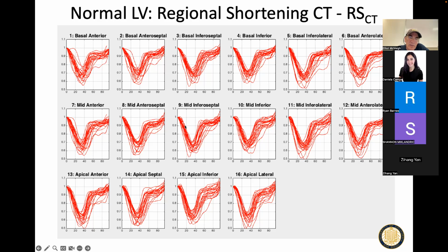As it goes down here, you can see this goes down to about 0.65 is the mean, something like that. That's the amount of reduction. So that's the area getting 35% smaller. Right. It's actually if you were to put a one-dimensional marker inside that area and saw how much the 1D marker went down.